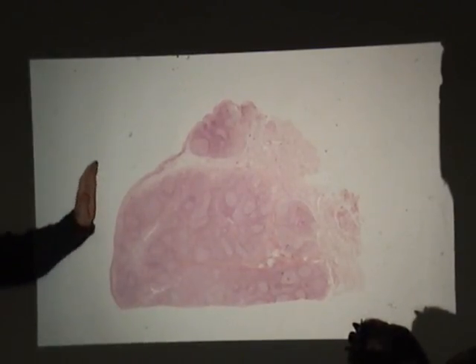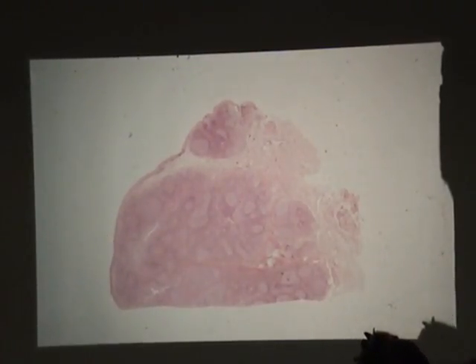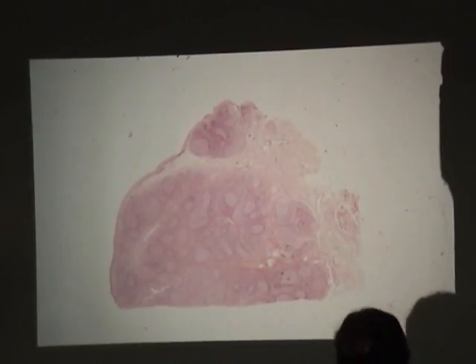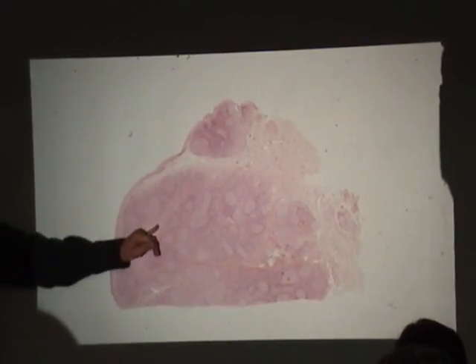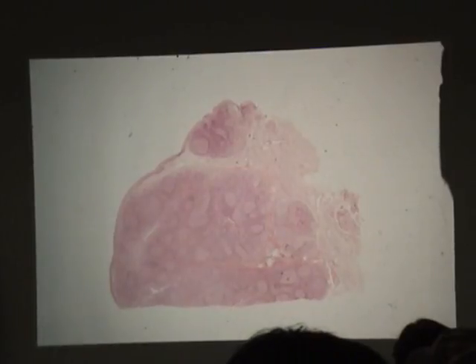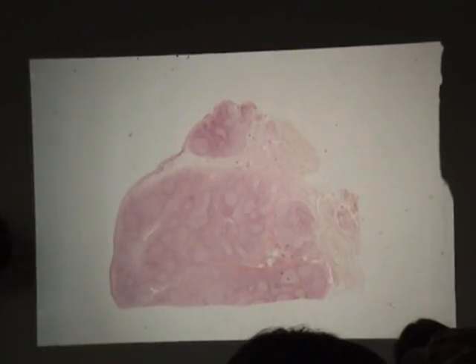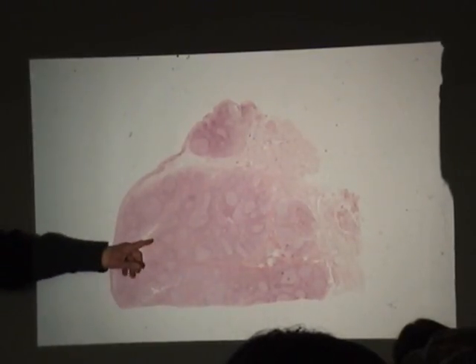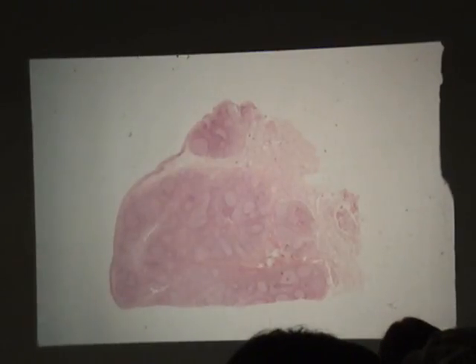So clearly, connective tissue, we've got an epithelial surface. If we went to higher power, we would know that this is what type of epithelium for a palate and tonsil? All right, I heard it all. That's what we want. Now, if you look at this, you can see these spaces right here. Those are going to be crypts. Now, some of you are going to be lucky enough to see the point where the epithelium invaginates into it. Those of you that aren't, you realize that above or below the plane of section, that space would be in continuity with this surface right here.